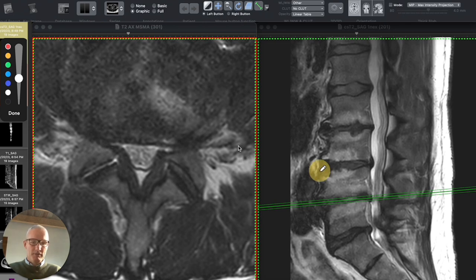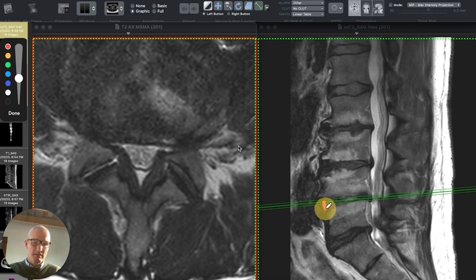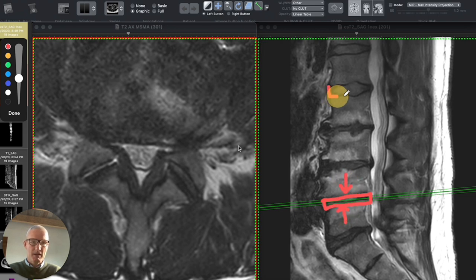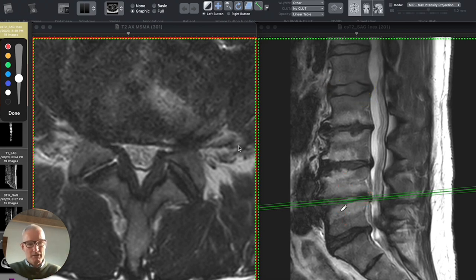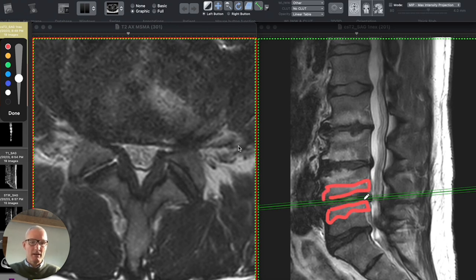At the L4-5 level here, this is the L4 vertebral body and this is the L5 vertebral body. We have a series of radiographic findings that are worth noting. The first is that there is evidence of degenerative disc disease. This disc here is relatively compressed when we compare it to a disc further up in the spine. As the disc has lost its elasticity and its flexibility, the bone underneath is showing signs of edema or swelling in the bone. And that is seen as this cloud of white signal here above and below the L4-5 disc space. We call those Modic end plate changes.